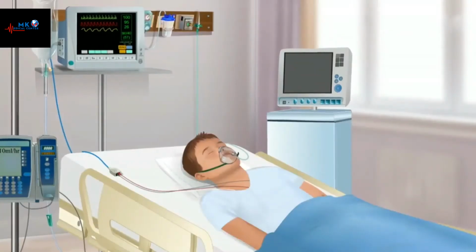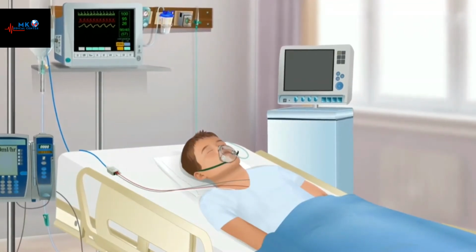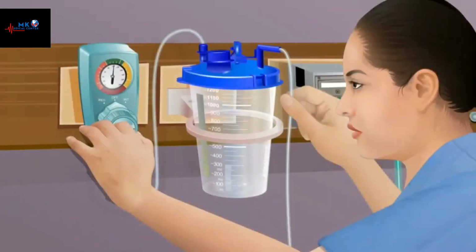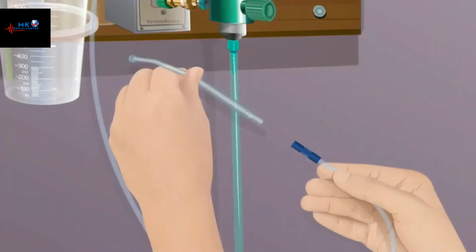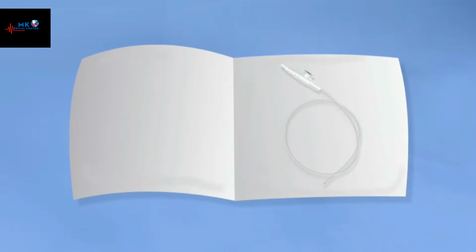Monitor the child's vital signs and indicators of adequate oxygenation and ventilation before, during, and after the procedure. Ensure that the suction apparatus is functional. Connect the suction tubing to a rigid suction tip catheter. Have pliable suction catheters available.